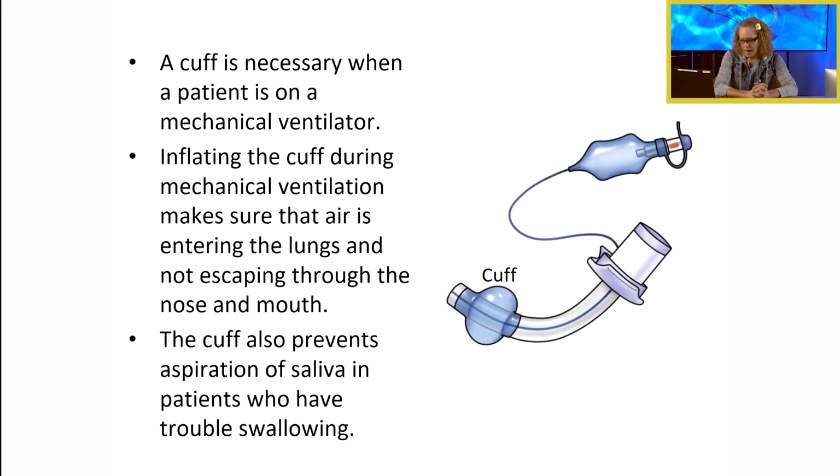So the cuff is necessary, as I mentioned before, when a patient's on a mechanical ventilator. Inflating the cuff during mechanical ventilation helps assure that the air is entering the lungs and not escaping through the nose and mouth. The cuff also prevents aspiration of saliva in patients who have trouble swallowing.